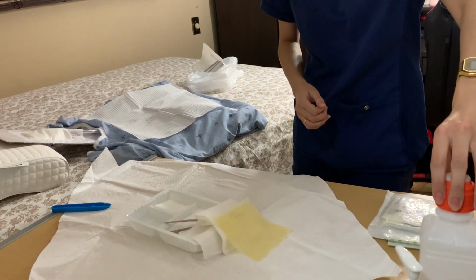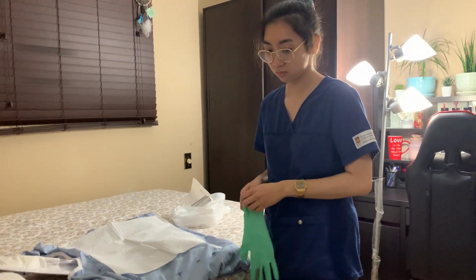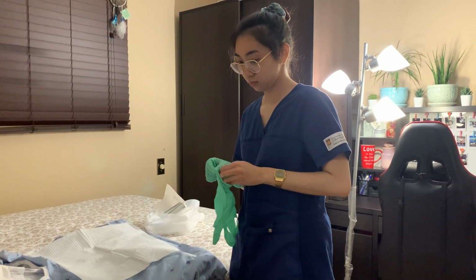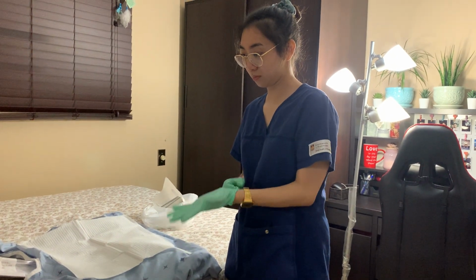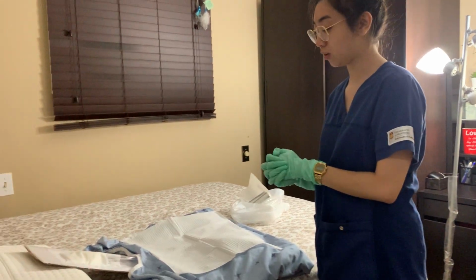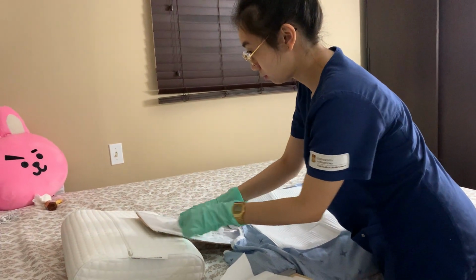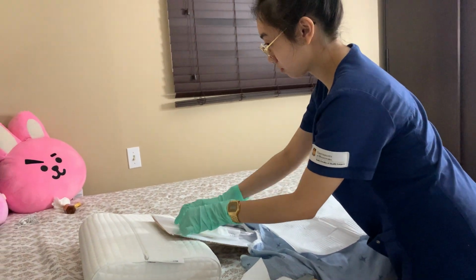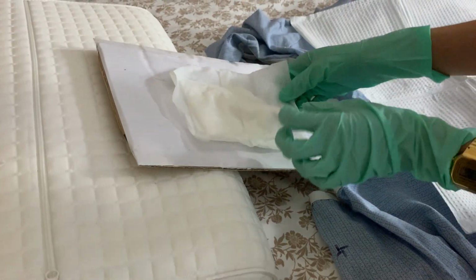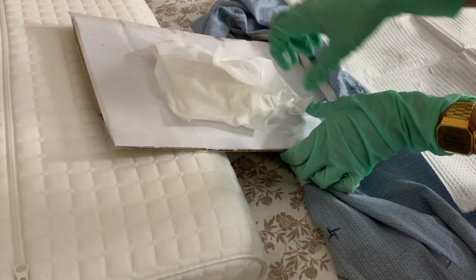Okay, and now I'm going to be putting on gloves and removing my old dressing. Okay, now I'm going to be removing the old dressing. So I'm just going to remove this. Okay, making sure that in real life we don't use scissors when we remove this. I'm also going to stabilize while I'm removing this.